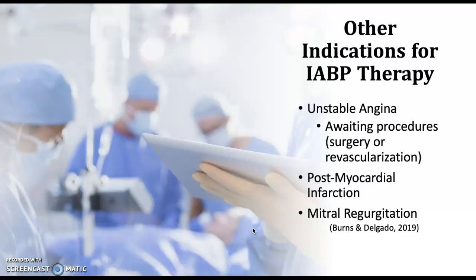The balloon pump is utilized here to stabilize patients who are waiting on procedures such as a PCI, which is a percutaneous coronary intervention where a stent is placed for blocked coronary arteries. This type of therapy also allows patients to get stabilized prior to a CABG, or coronary artery bypass graft, a surgery, or even a heart transplant. So the patient may be experiencing unstable angina, and therefore the balloon pump is used to reduce or eliminate symptoms and support the patient in preparation for surgery or revascularization.